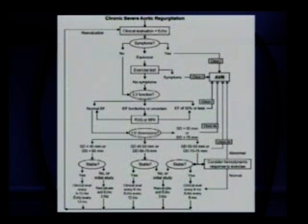So the top one here says clinical evaluation plus echo. Symptoms, no. Look at LV function. If the ejection fraction is normal, then you don't have to worry. But if the ejection fraction is borderline, and if the LV dimensions are diastolic more than 75 or systolic more than 55, then these are some of the indications for surgery. But if there are symptoms, or the exercise test is positive, that's a class 1 indication for aortic valve replacement, right?